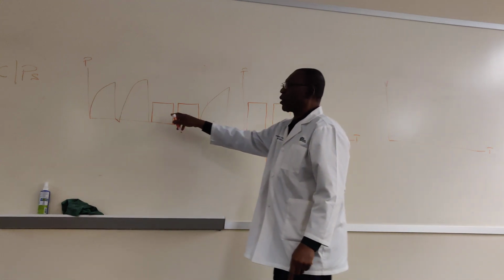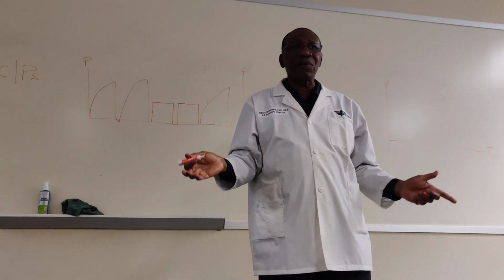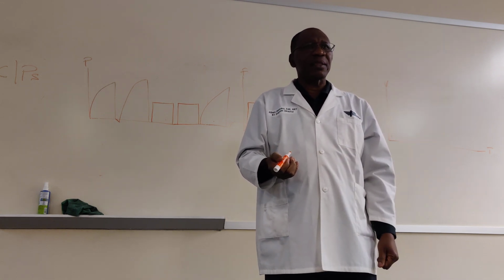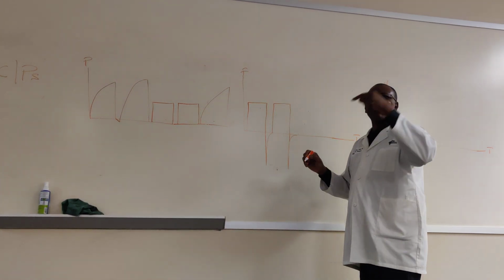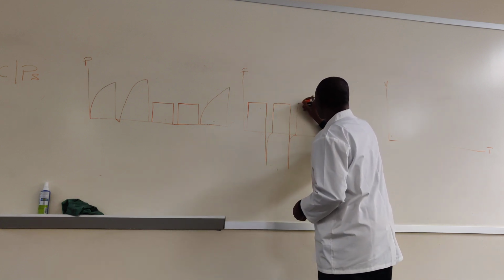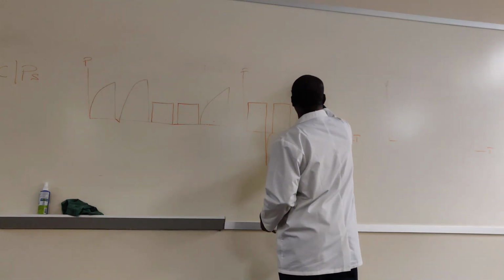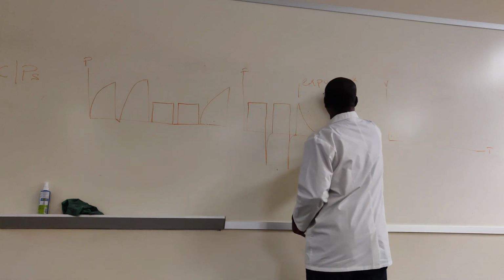Well, here is a pressure supported breath. On pressure support, remember, we don't set flow. The ventilator brings out the amount of flow it wants to bring out, according to how well the patient can suck in. So, when you look at it, it will be what we call a decelerating ramp. So it goes like this. It goes like that. What they call this is exponential decay.